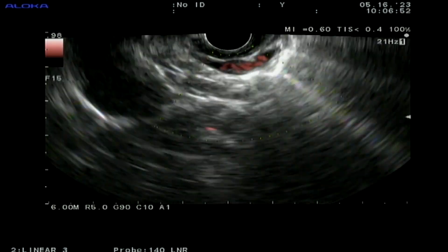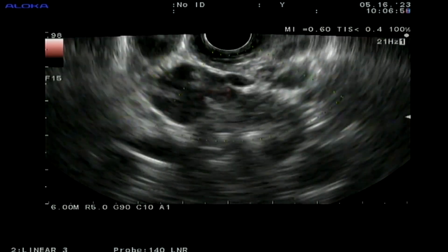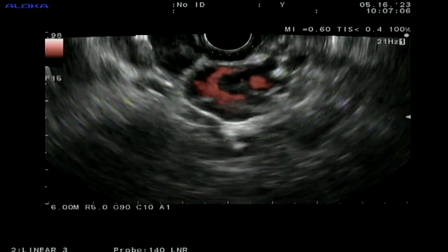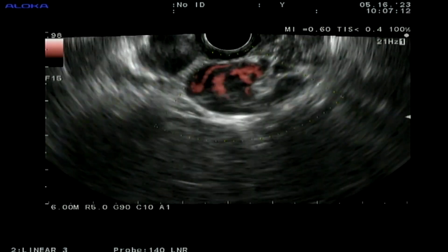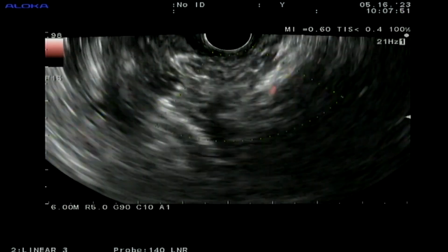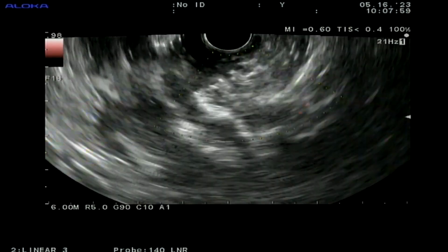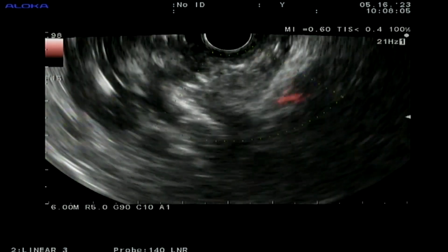So this is outside there, what you're seeing with Doppler. That's all outside. This is also all outside. All of this signal that you see here, these are the gastrorenal shunts, really. So you don't want to inject into this. It'll just flow right away into the circulation. See the outline of the stomach. This is all obliterated. It really looks fantastic. I think we're only seeing the collaterals because all the varices themselves are gone now.